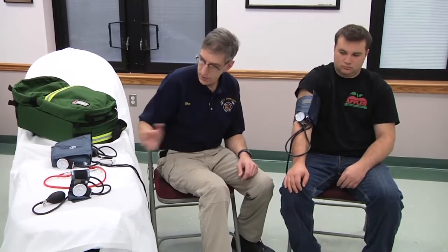Now, in the environment that we work in, oftentimes you can't hear blood pressures. It's difficult with the stethoscopes that we carry to hear an actual blood pressure. So there are a couple things you can do. One of them is palpation — you can palpate the radial pulse on a patient, pump the blood pressure cuff up, and as the blood pressure cuff deflates, you feel the radial pulse come back. That's your systolic blood pressure.